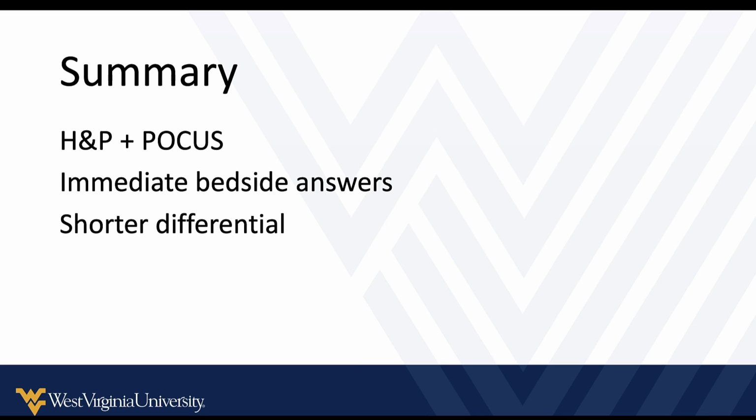So, a quick little summary, just as we've said before: you get the biggest benefit when you incorporate point-of-care ultrasound as an additional component to your history and physical. You can get immediate bedside answers, sometimes find and confirm the diagnosis in seconds. Or if you find a negative or normal study, that's going to change your differential and make your differential diagnosis shorter and make the rest of your workup more efficient, and can be a really powerful tool that can help you in these patients who have these different symptoms of abdominal pain or swollen areas.